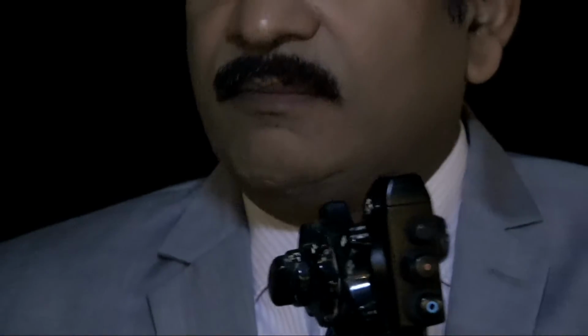These digital buttons, you have to learn how to program them, because there is no fixed function for these buttons. You have to program them, because the same button can be used for different functions. The same button you can use for freeze, for increasing the shutter speed, for printing an image, and for recording the video. So you can assign your function according to your habit. And you can put your name and save it by your name in the endoscope. So how to do it? We will demonstrate. So they are digital buttons.